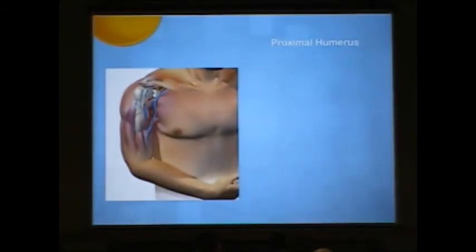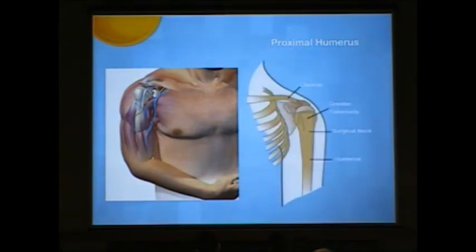The proximal humerus is something that some clinicians are not very familiar with, and we're finding more and more that this is really the site of choice. It's a site of choice for many reasons. Anatomically, it's a very large area, and there's nothing to worry about injuring there. The only thing you have to avoid is the bicipital groove where the biceps tendon crosses.